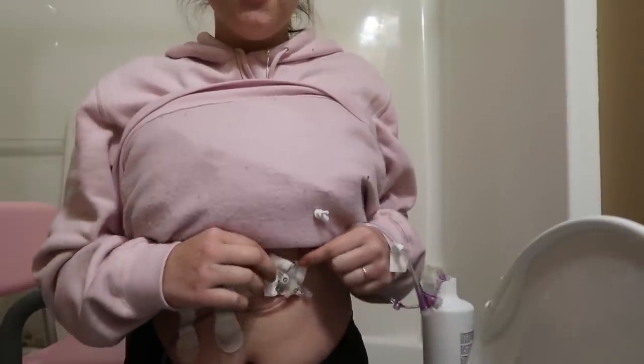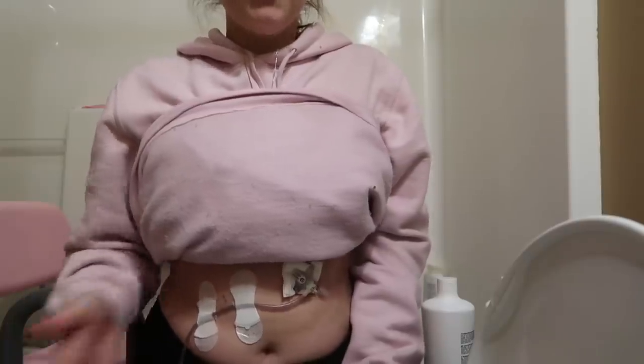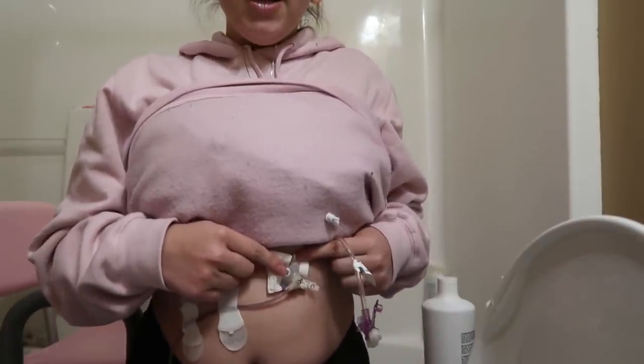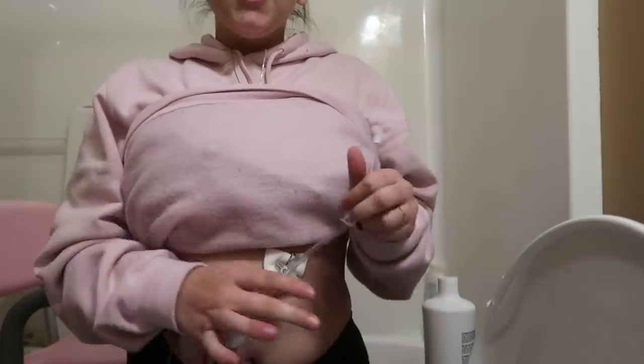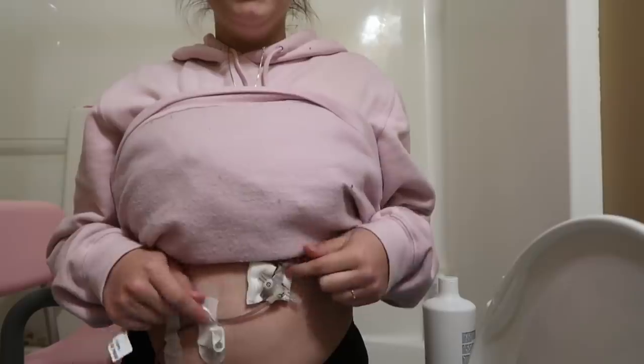This is my feeding tube. I have a little gauze around it. This is my J port right here, which is where I get my feeds, my medicine, and all that stuff. Then there's another little port right here — this is my G port — and this is the extension that I use for my G.